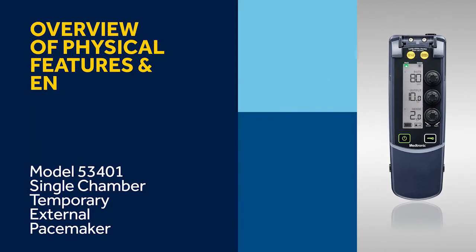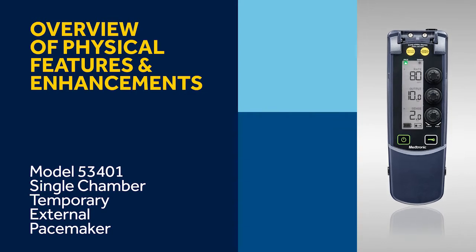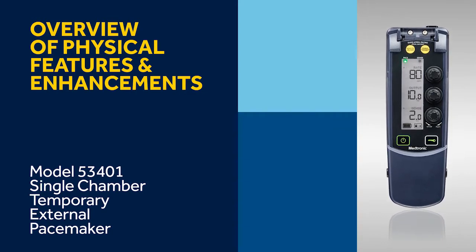In this video, we demonstrate the features of the 53401 and some of its basic safety and ease of use functionality.